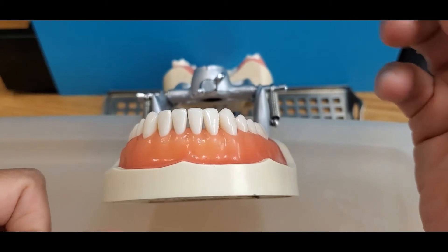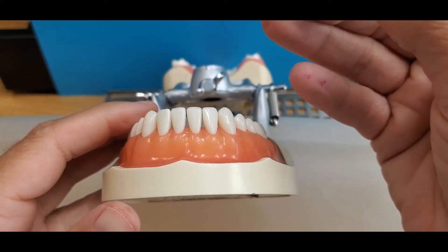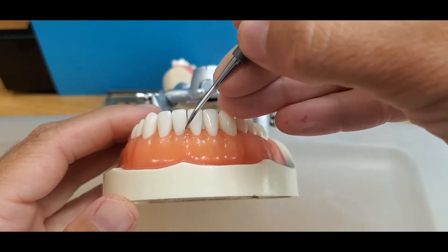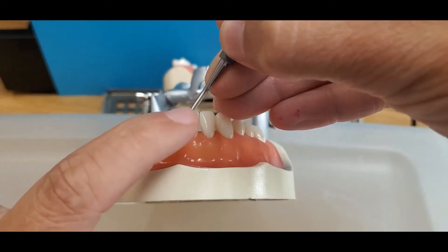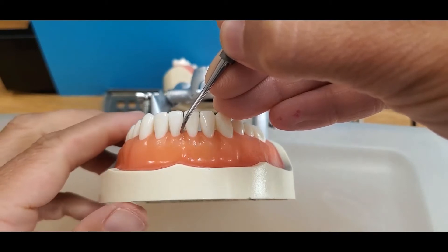To determine the correct working end of an H67 on the anterior teeth, there are two ways to do this. One way is to fulcrum on the canine, place the instrument on the central, and then look for the end where the terminal shank is more parallel to the long axis of the tooth.